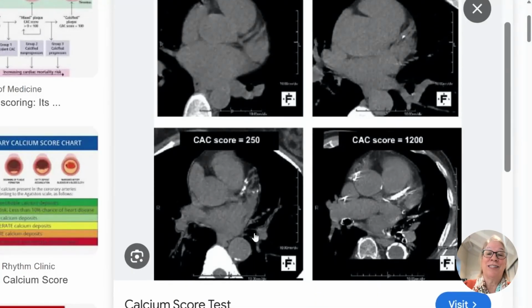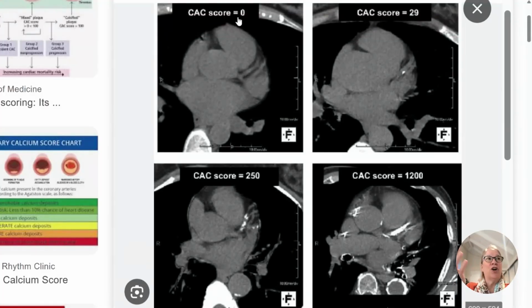You can also see on the CT scan the descending aorta, the part that goes down from the chest to the rest of the body. And in this patient, there's a lot of calcium in that artery as well. So cardiologists use the coronary calcium score to help determine when patients have intermediate risk for coronary disease, to determine whether there's coronary disease present or there's no calcium present.